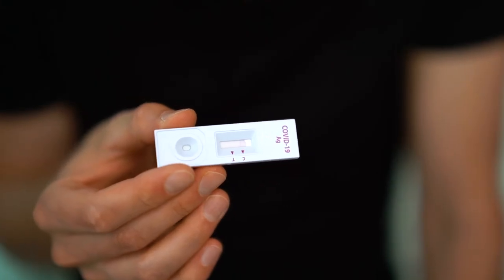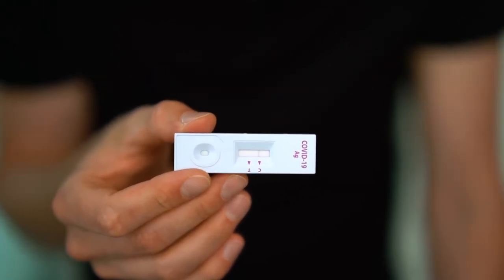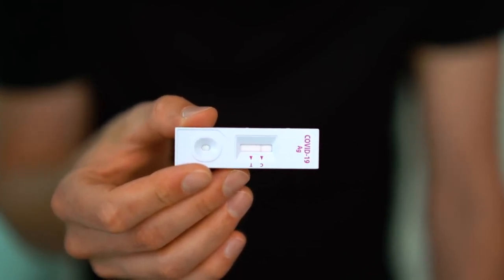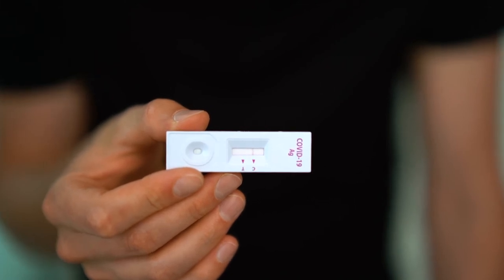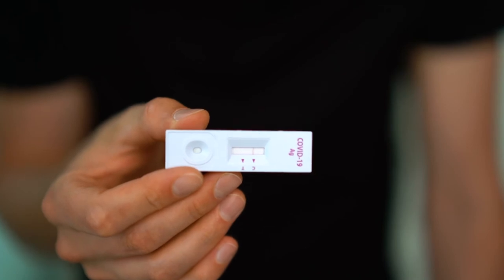Now we just have to wait 15 minutes. This already shows that I don't have COVID. I was pretty confident I didn't because I've been tested so many times and they've all come back negative, and I haven't met anyone that has COVID. So yeah, it shows just one line and that means I don't have COVID.